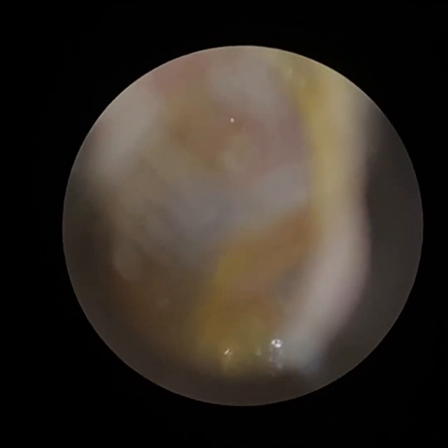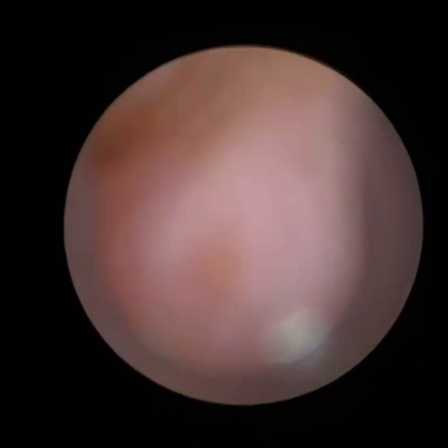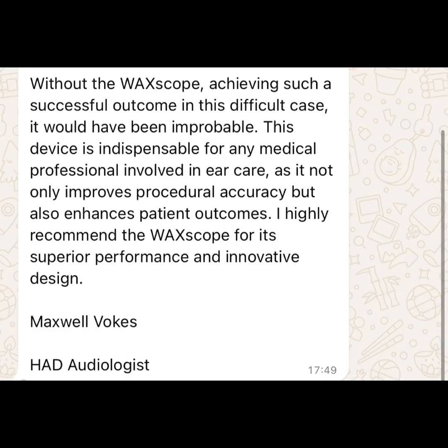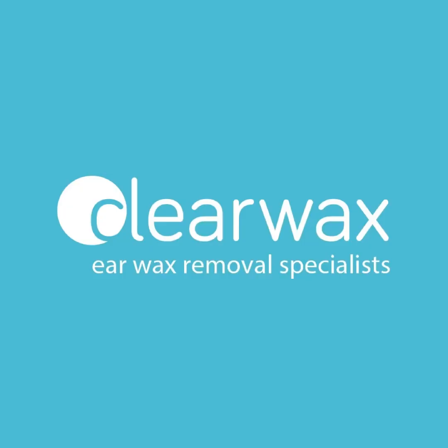You can see he managed to dilate it a bit more there. On the left-hand side he's pushed that cartilage and he's just going to get the eardrum in focus. I apologize if the video quality is not great — when it's sent via WhatsApp and then uploaded you do lose some quality. But the video quality when Max is performing would be exactly the same as in my Clearwax videos. And that's the testimonial Max gave and the review from the patient. Well, I hope you enjoyed that video, guys. Take care, keep well, and speak soon. Bye.